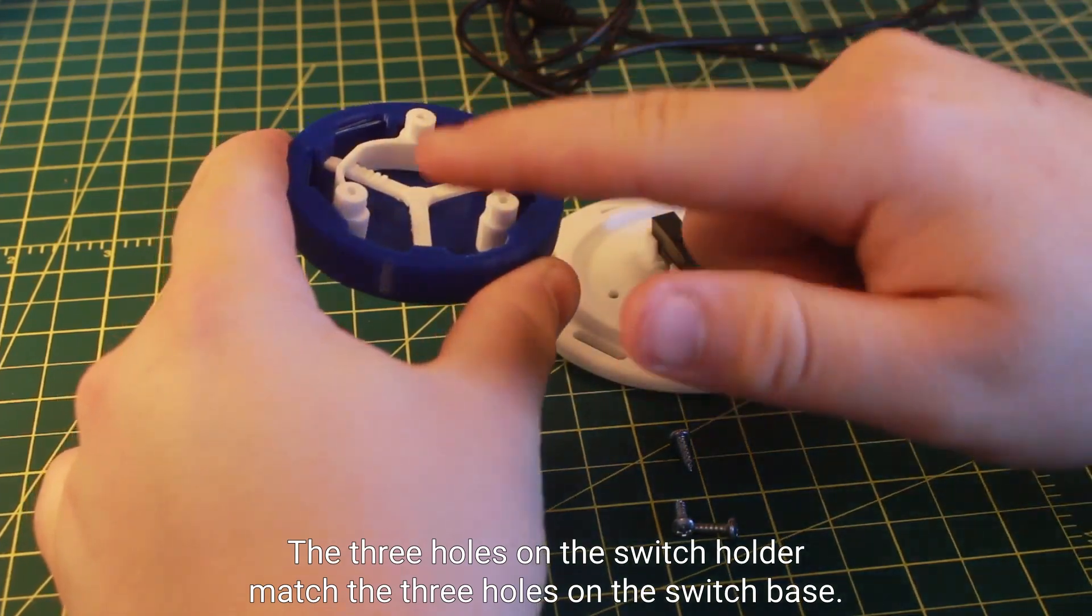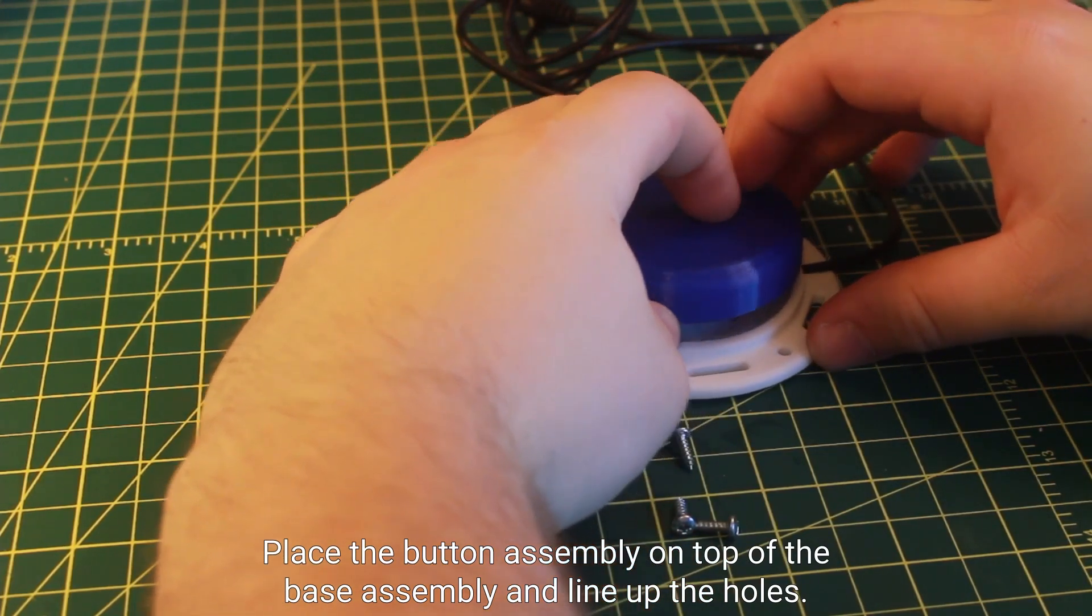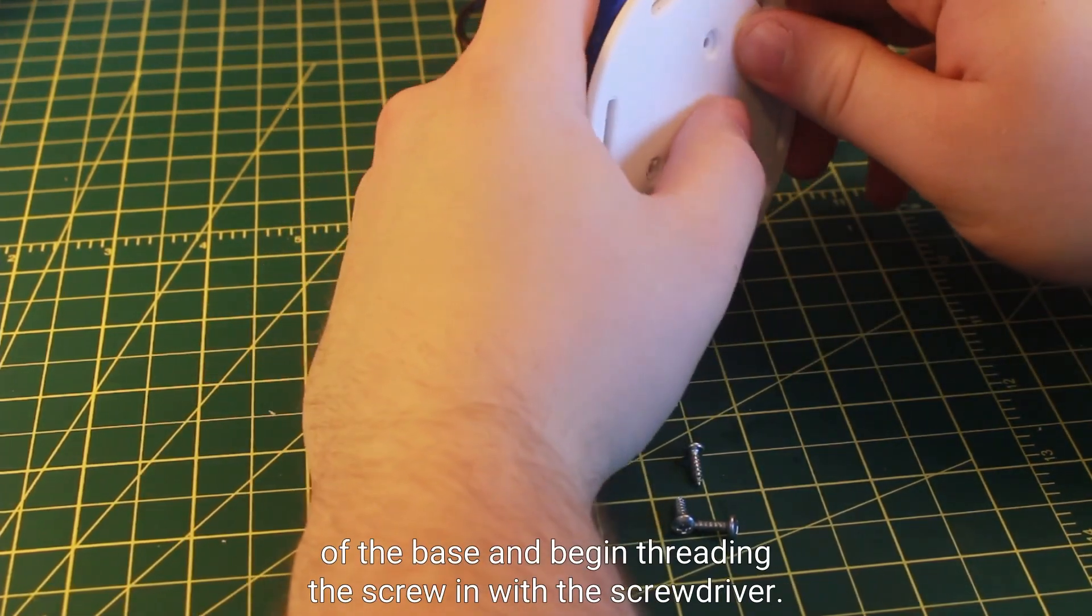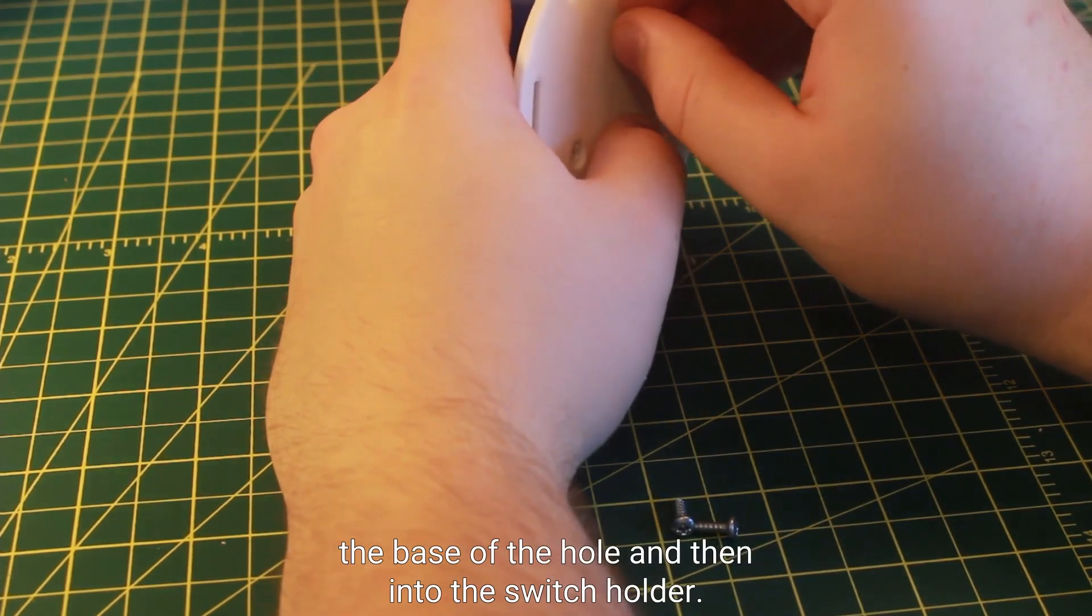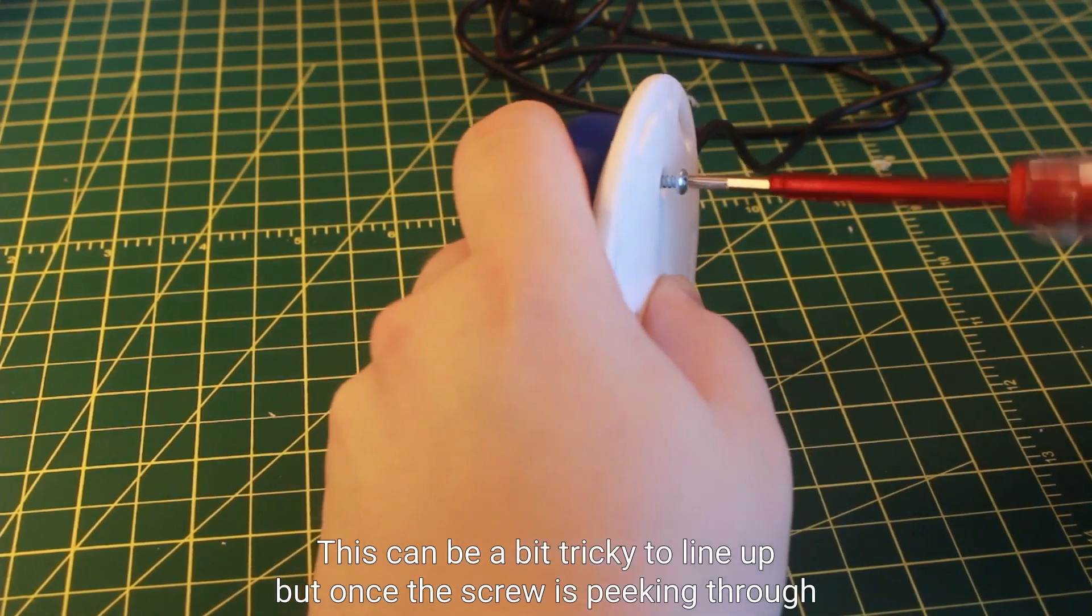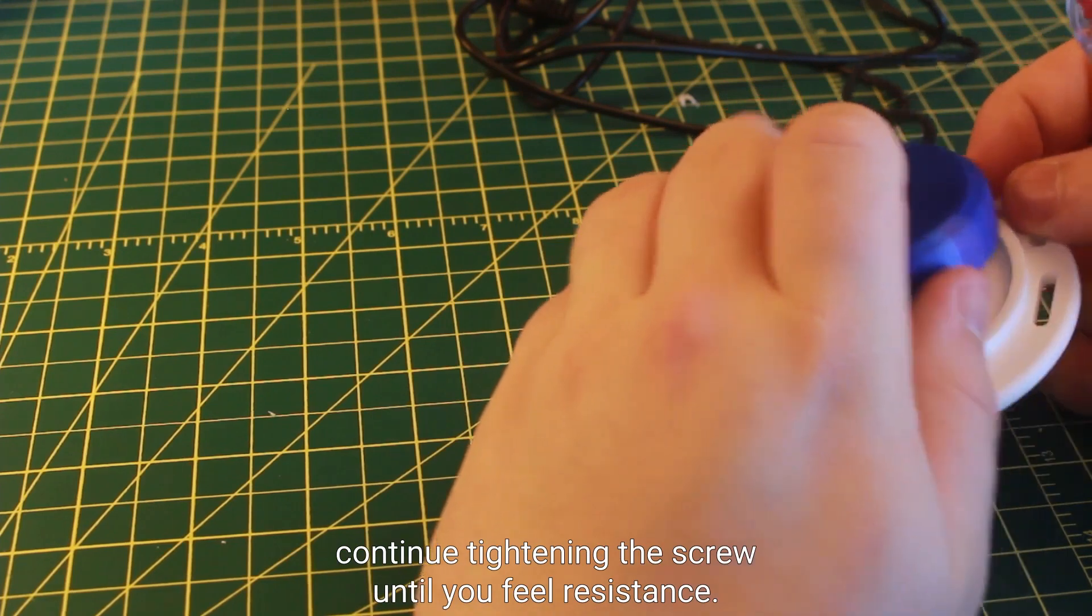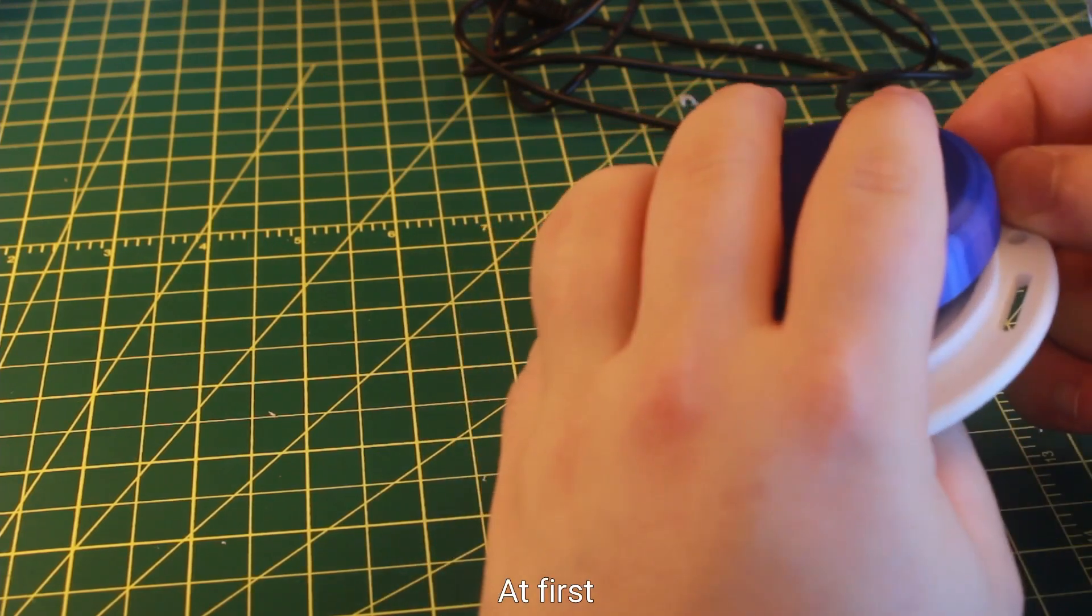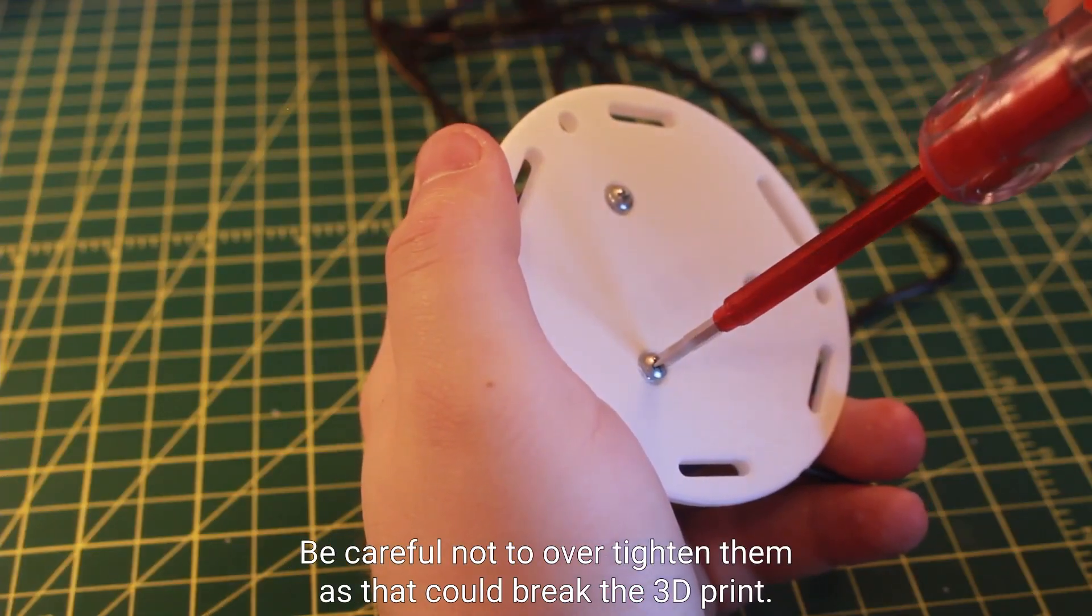The three holes on the switch holder match the three holes on the switch base. Place the button assembly on top of the base assembly and line up the holes. Then take one of the three screws and place it into the hole on the bottom of the base and begin threading the screw in with the screwdriver. We want the screw to go both through the base of the hole and then into the switch holder. This can be a bit tricky to line up, but once the screw is peeking through the base it will be easier to line up the hole on the switch holder and then continue tightening the screw until you feel resistance. Be careful to not over tighten and tighten them all loosely at first. Go back over the screws and tighten them until you feel resistance. Be careful not to over tighten them as that could break the 3D print.